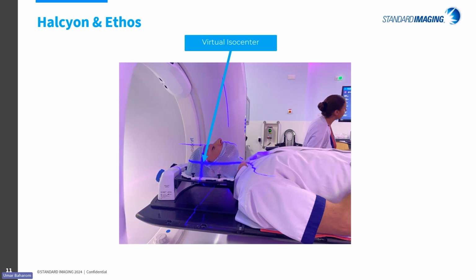First you want to set the TruPose in position with the 2-pin indexing bar, just like in the CT room. Then you want to ensure that the pitch, roll, and yaw indicators are set to 0. We don't generally see adjustments needed of more than 2 degrees, but setting all the indicators to 0 allows you to have the maximum adjustment range for positioning the patient's head. Then the user can assist the patient onto the TruPose head adjuster, and then you can secure the mask.